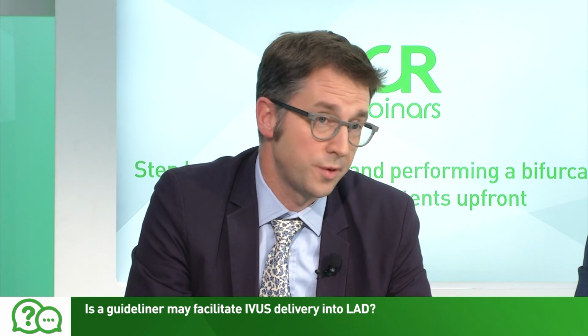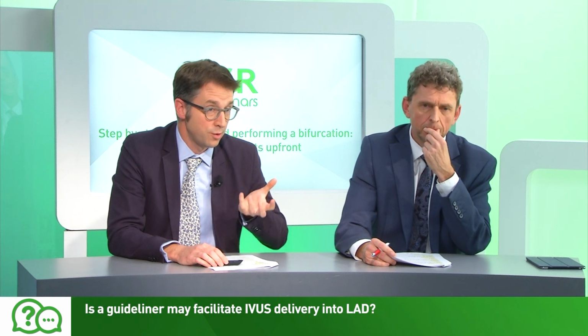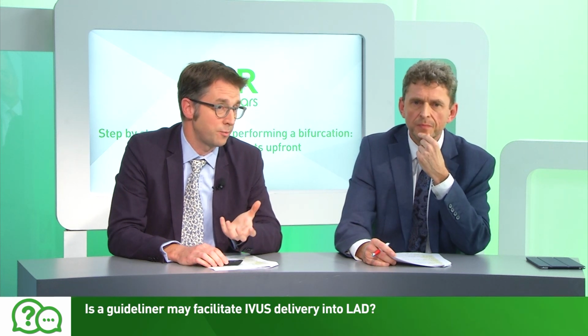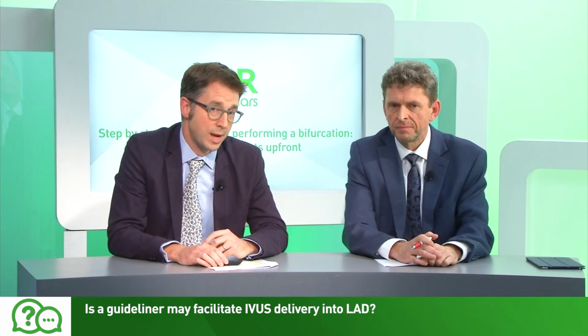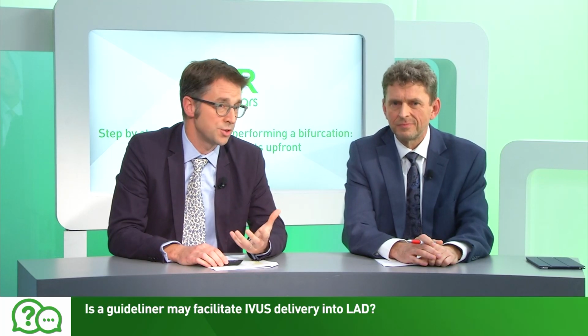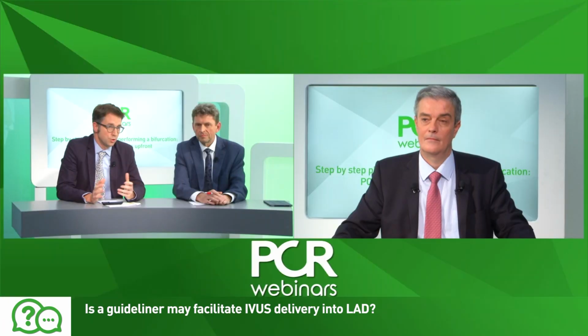And I have to say that often in my practice for left main, I'll use a very passive guide for fear of engaging too heavily into the left main stem. And I think we're facilitating passage of equipment by the preparation, so by the rotablation. Actually, the guide catheter becomes less of an issue, I believe. But it's a good point.